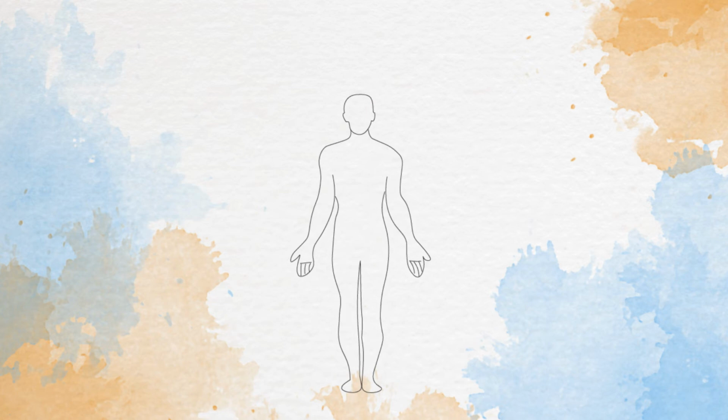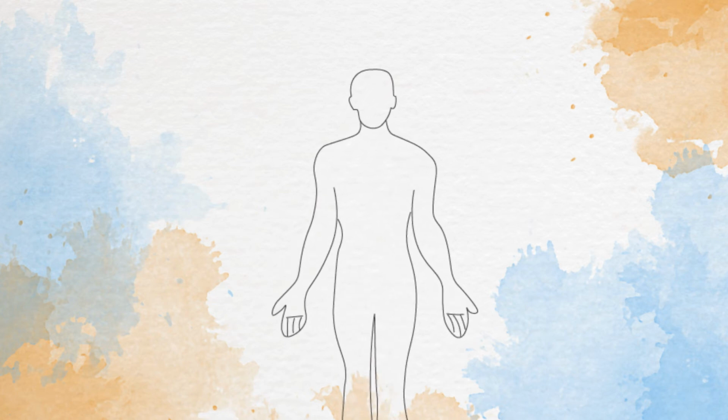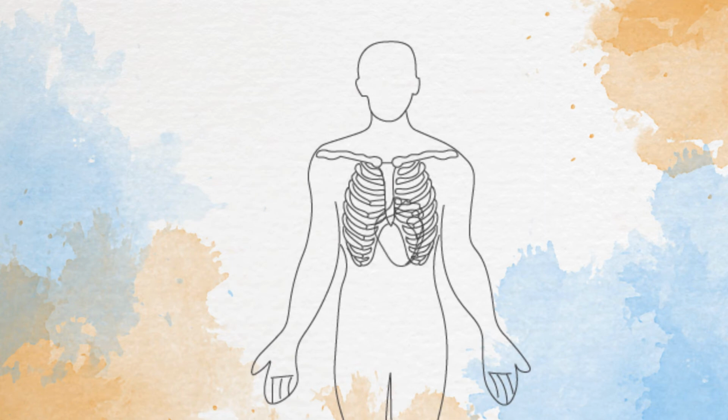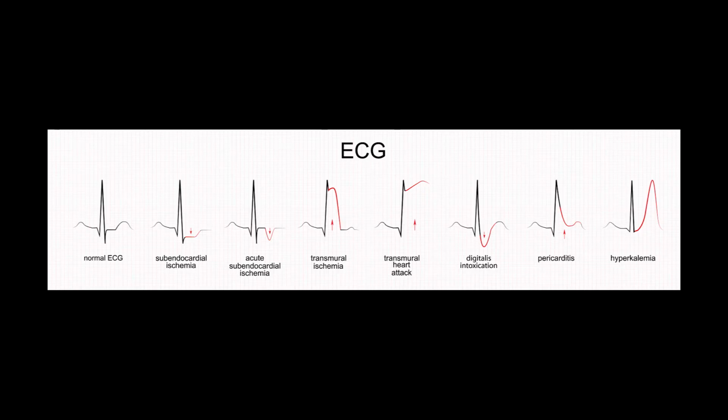To a trained clinician, an ECG conveys a large amount of information about the structure of the heart and the functions of its electroconductive system. Among other things, an ECG can be used to measure the rate and rhythm of the heartbeats, the size and position of the heart chambers, the presence of any damage to the heart muscles, and the effects of heart drugs and implanted pacemaker devices.